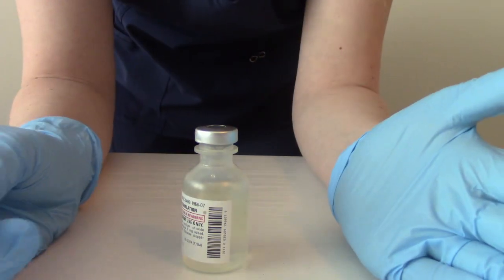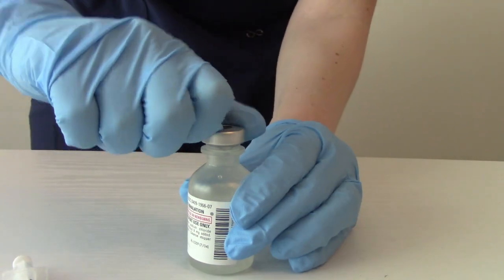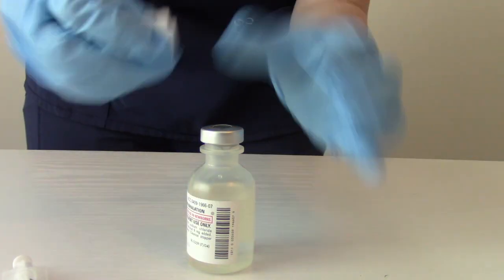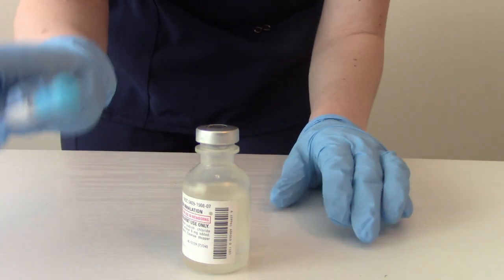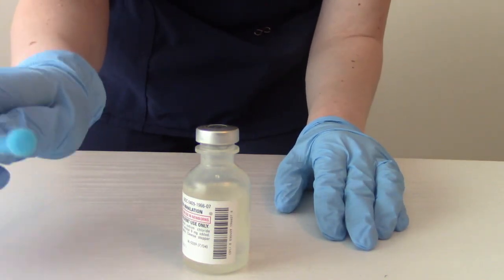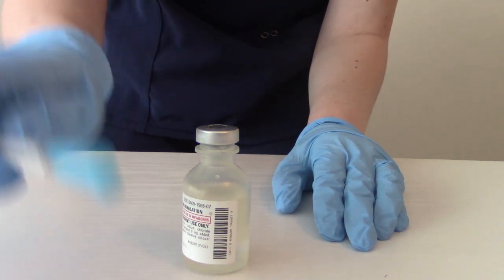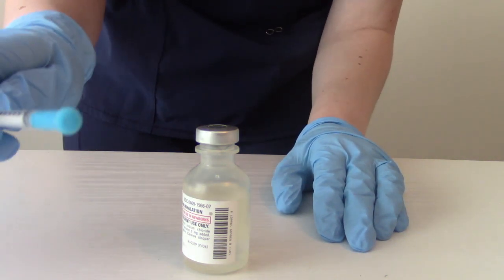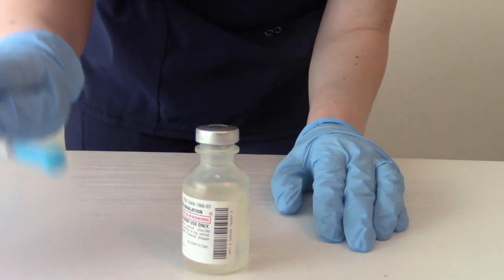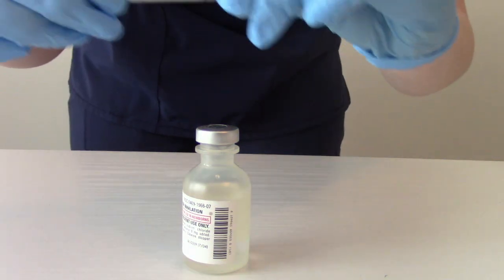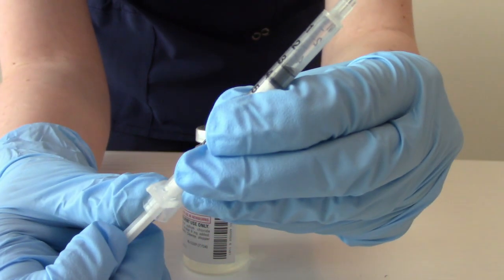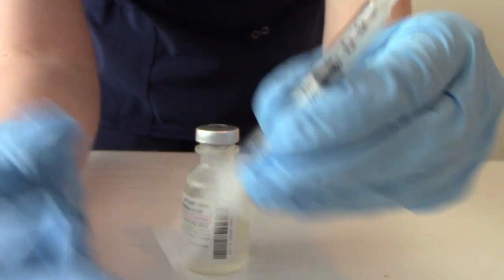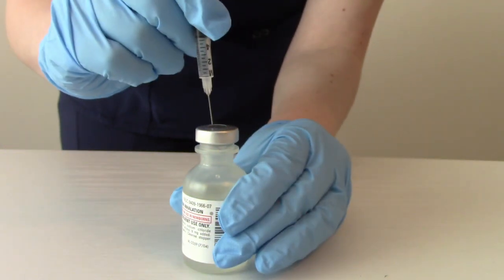So now we're ready to draw up. We're going to pop off the cap, alcohol wipe, and we're going to draw back our air. The amount of air we draw back is the amount of fluid we are going to take out of the vial. So let's say it's 0.3. We're going to pull back to the 0.3 of air, inject that, and then flip it upside down and pull back 0.3 of the fluid.